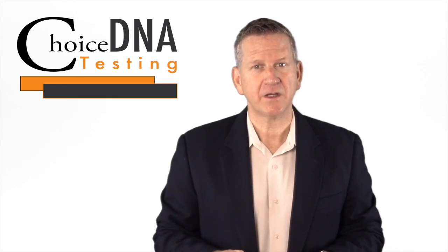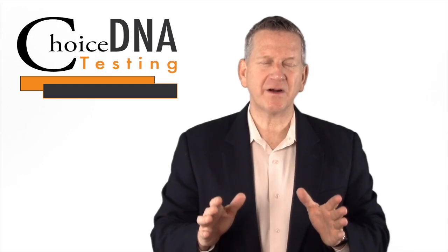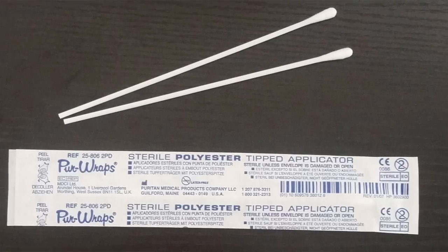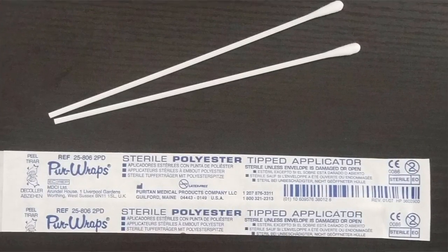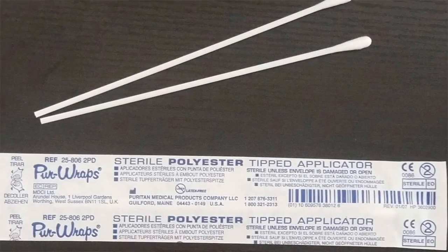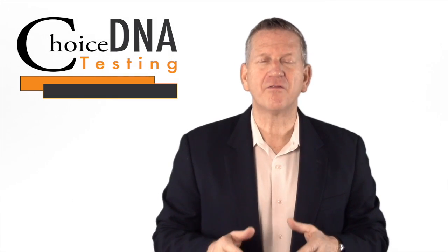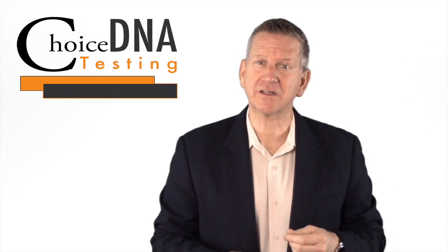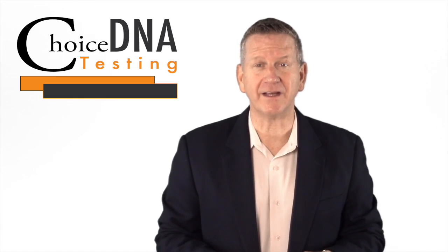Number two, next you'll want to collect the samples. Don't worry, this part is easy and painless. All you have to do is open the wrapper at the opposite end of the polyester tip, remove one swab from the package, and be careful not to touch the polyester tip. Be sure that your mouth is open wide, insert a swab into the mouth, and rub it firmly up and down inside the cheek for a full 30 seconds. Be sure to rotate the swab to collect cells on the entire swab tip — this helps reduce the need for recollection later.